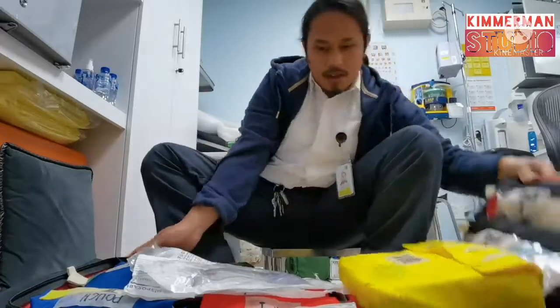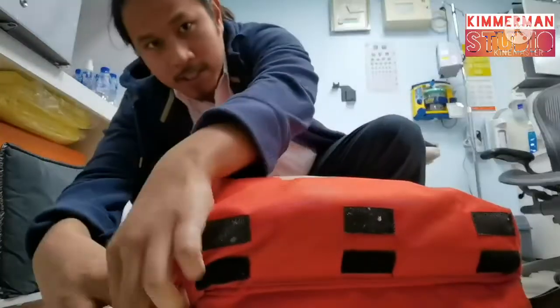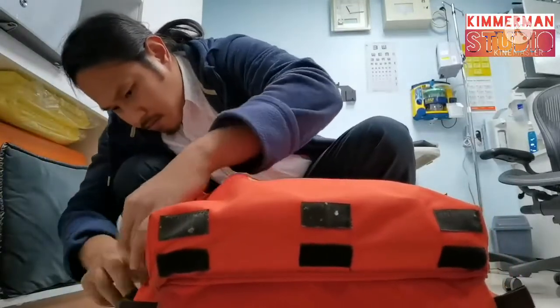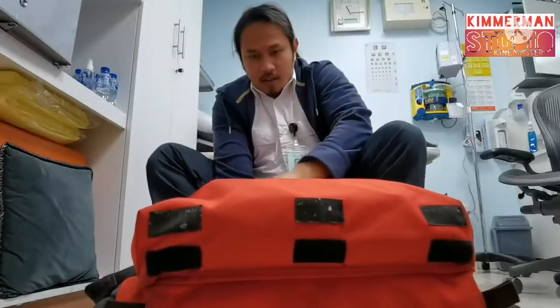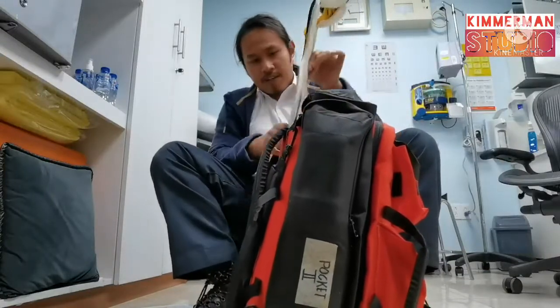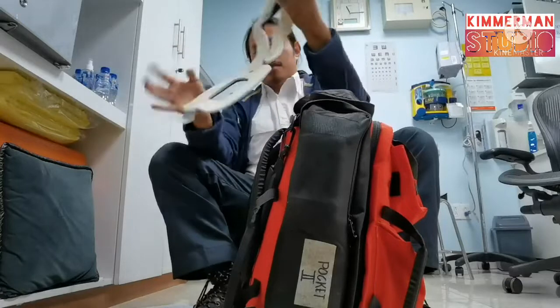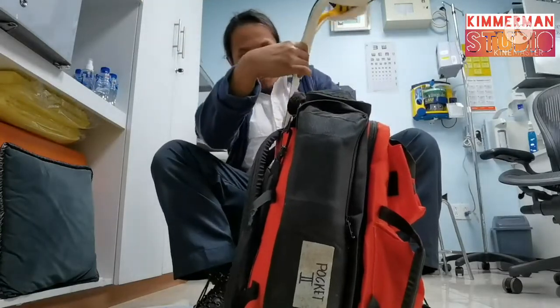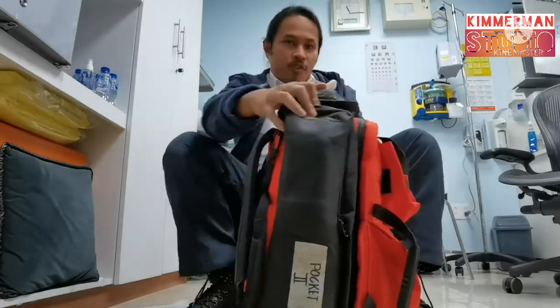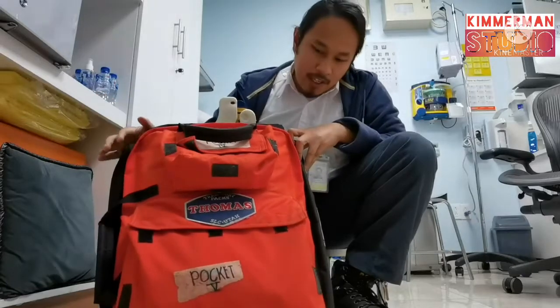Let's close the bag now. I'm confident that my bag is complete. On the outside we also have the cervical collar — it should be placed here.